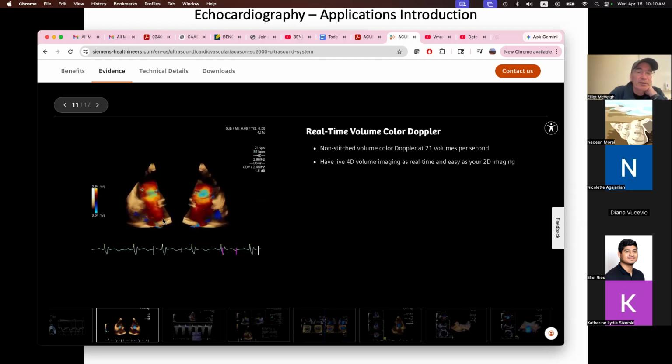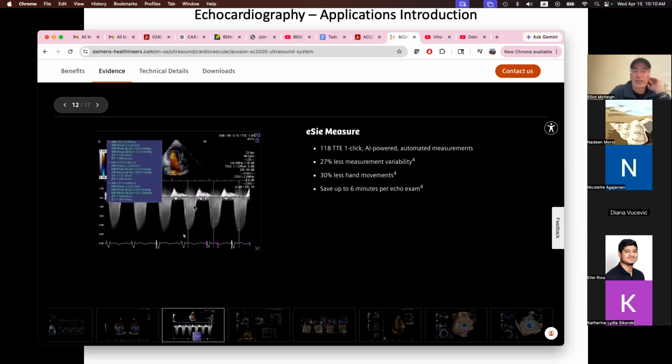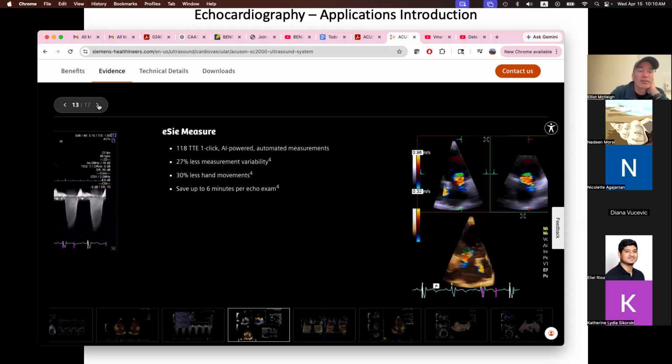So again, color Doppler, you can see now you're experts, right? So we see the red, the flow is going towards the transducer that's up here. And then the bad news is this, right, is blue shooting the wrong way through the valve, okay? You can measure that precisely by looking at the signal itself, and we looked at that briefly before. You can trace out these patterns of velocity and get very quantitative estimates of that velocity.